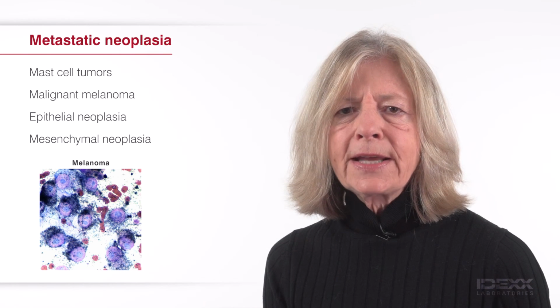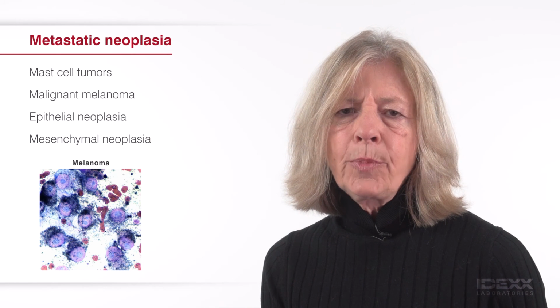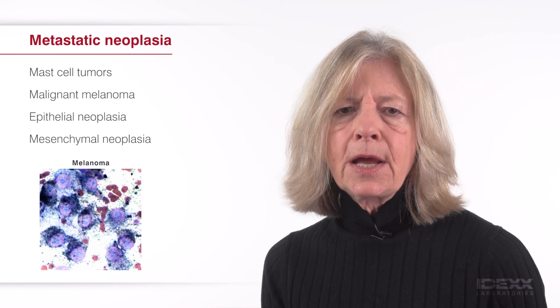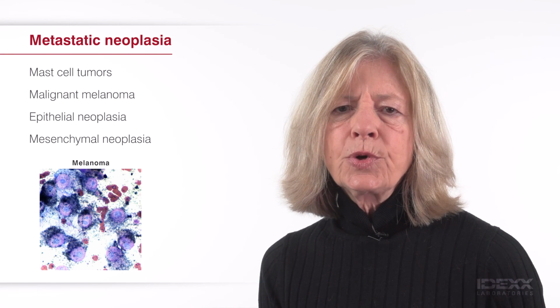If numerous metastatic cells are present, cytology is helpful. However, the absence of neoplastic cells on cytology does not preclude the diagnosis of metastasis. Histopathology is more sensitive in the detection of metastatic disease.